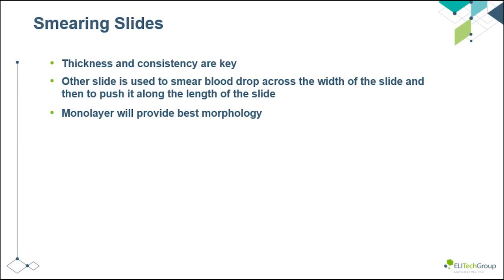As a former field service engineer, I know that almost anything mechanical can have issues. Most laboratorians learn to create blood smears by putting a drop of blood near the frosted edge of a slide, and then using another slide to let you wick blood across the width of that slide. Once the blood has gone across the slide, you then push the drop across the length of the slide.